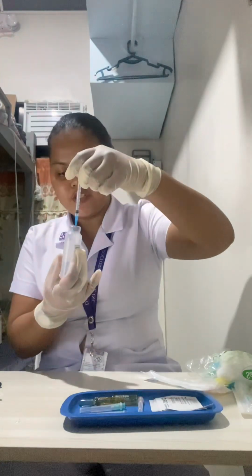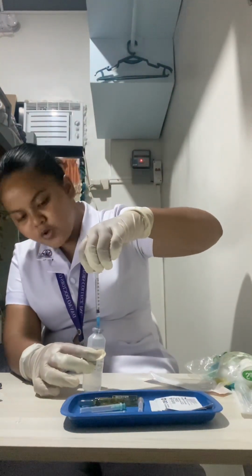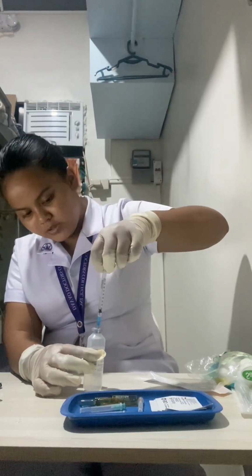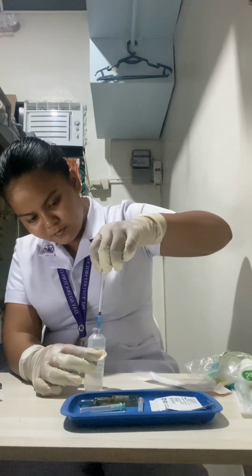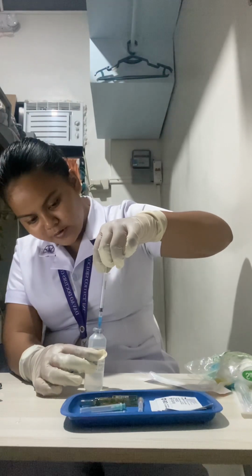After making sure that the bevel is below the surface, I am now going to withdraw the prescribed medication, which is 0.5. You have to do it gradually so that no air is drawn in.